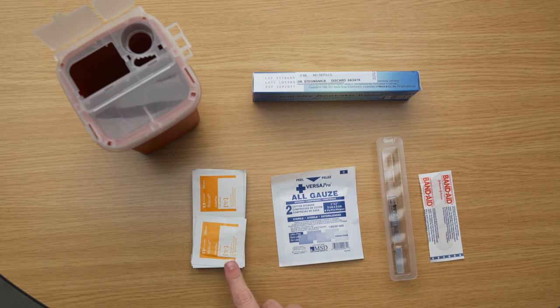An alcohol swab, one pre-filled syringe of Ganirelix acetate for injection, sterile gauze, a safety container, and a band-aid.